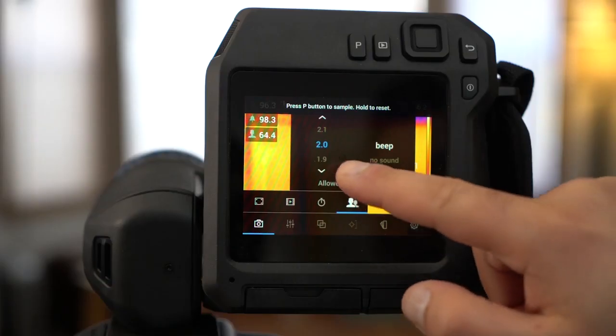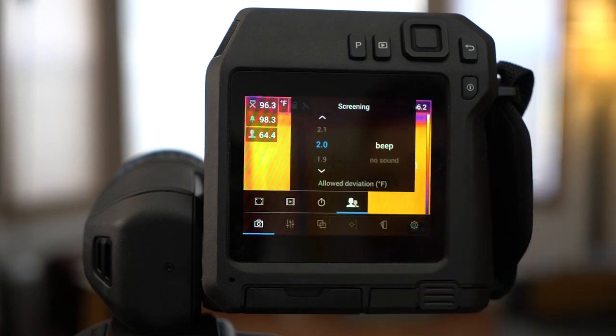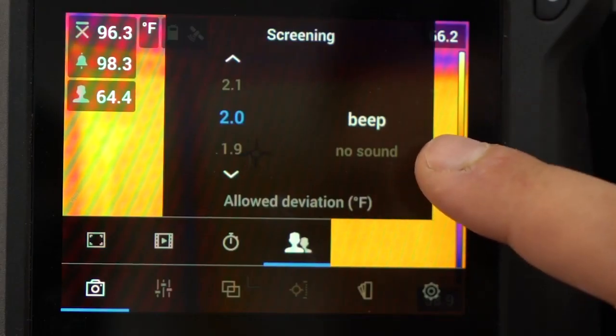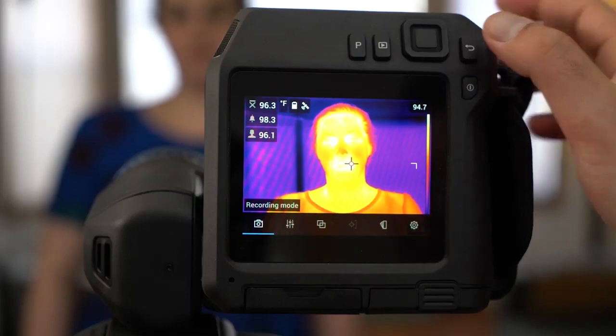Here's where you can set your alarm threshold. We're in degrees Fahrenheit, so we'll set the threshold to 2 degrees. You can also choose to turn the audible alarm on or off. Exit the menu.